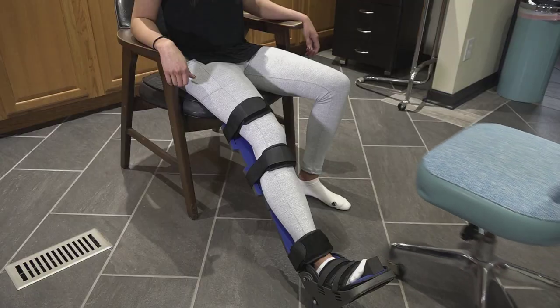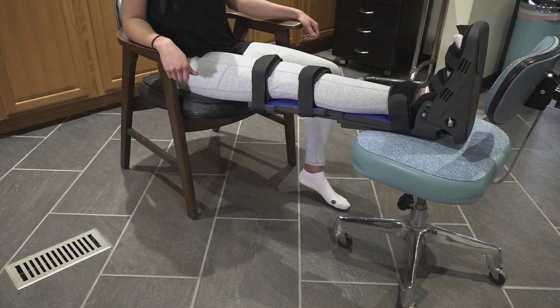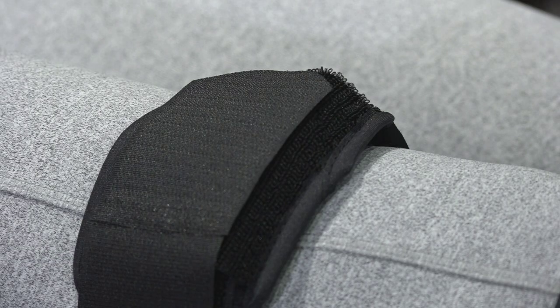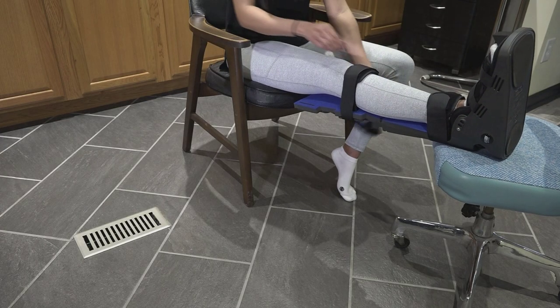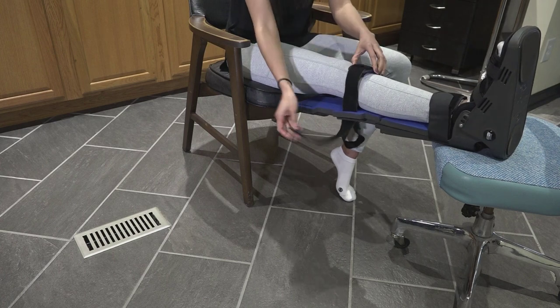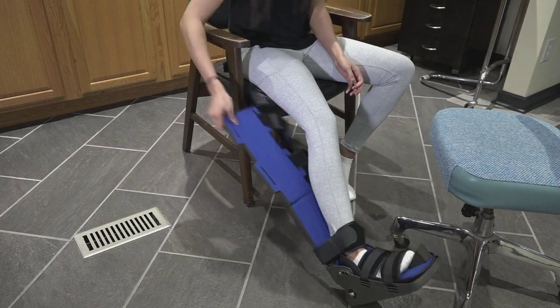Now, kick your leg up on another chair or an ottoman. Start your time and watch your favorite show or read a good book. To get out of the brace, simply release the leg straps and push the post back to the outside of your leg. This way you can bend your knees to easily access the ankle and foot straps.